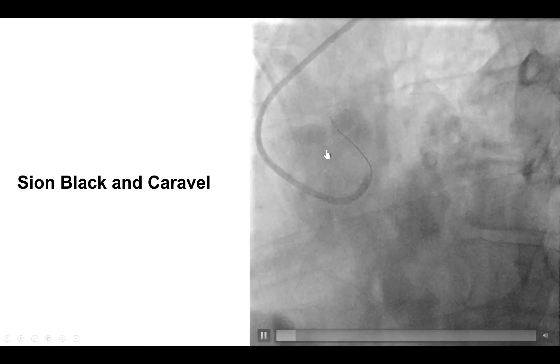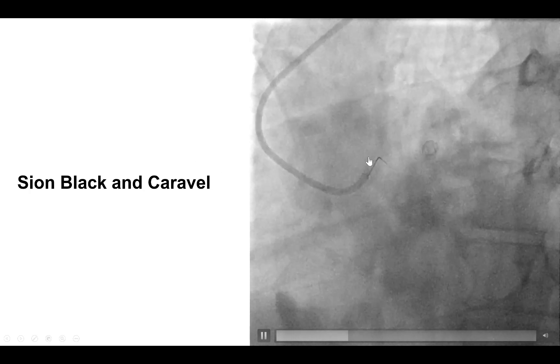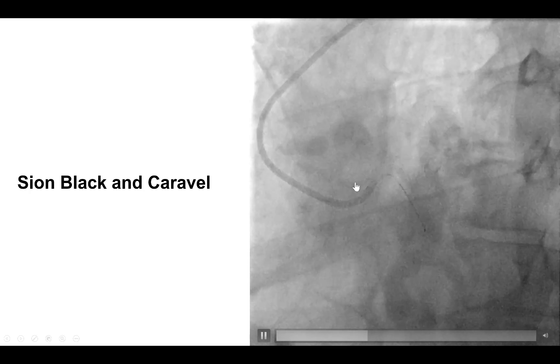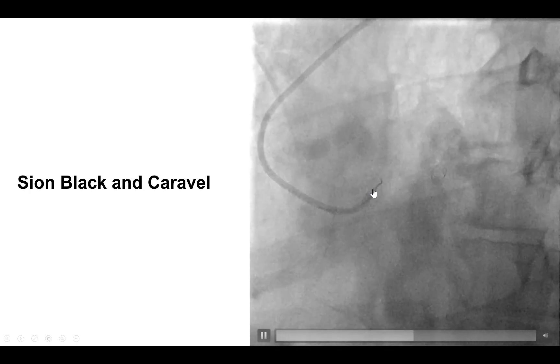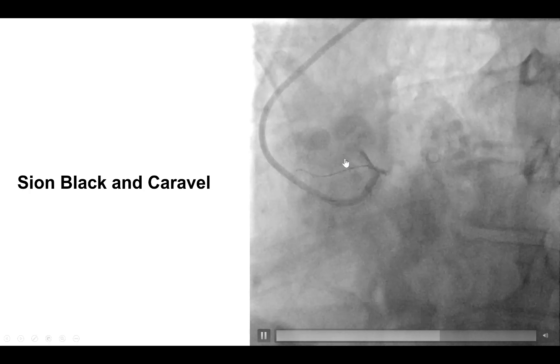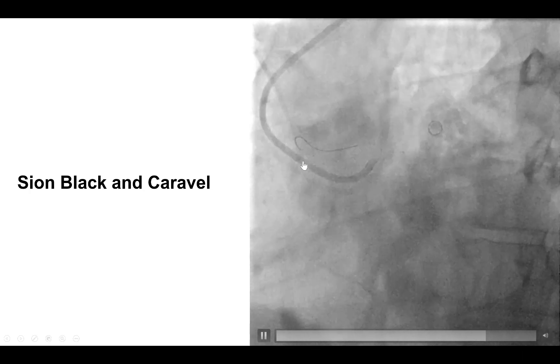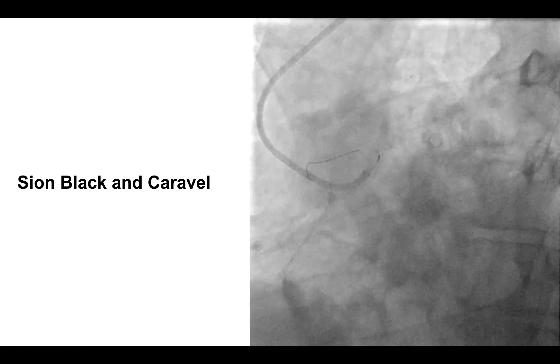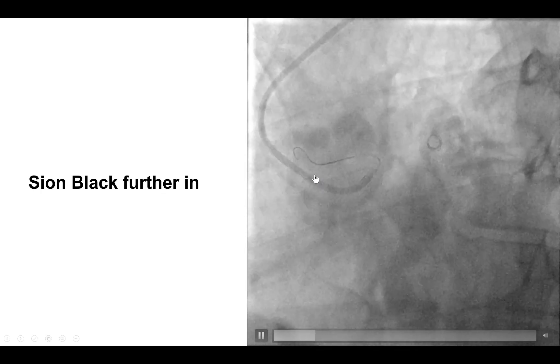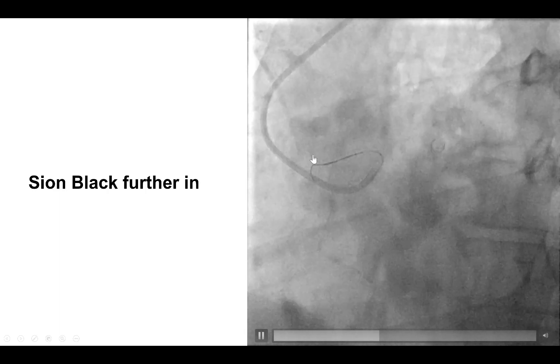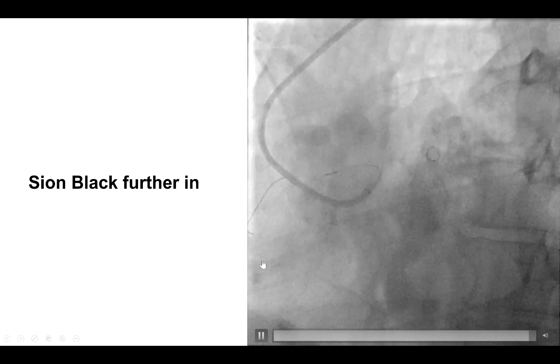To overcome this difficulty, we used a Caravelle microcatheter together with a polymer-jacketed Sion Black guide wire — the hope being that there would be less resistance to advancing the polymer-jacketed wire, and also that the microcatheter would help support the wire to advance further. The Sion Black indeed seems to be advancing along the course of the vessel, much further than before. After advancing the Caravelle microcatheter slowly, we had more support to continue advancing the guide wire further down, and eventually the wire found its way into the vessel.